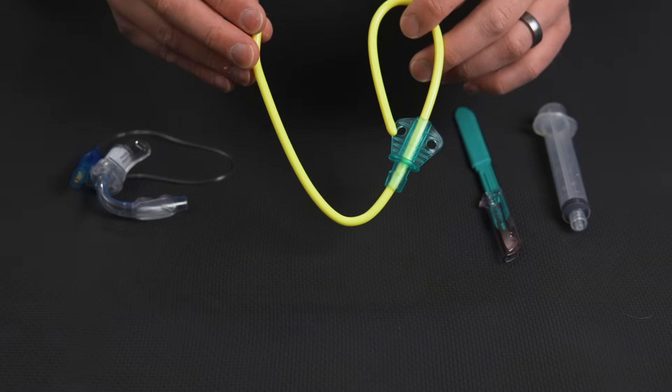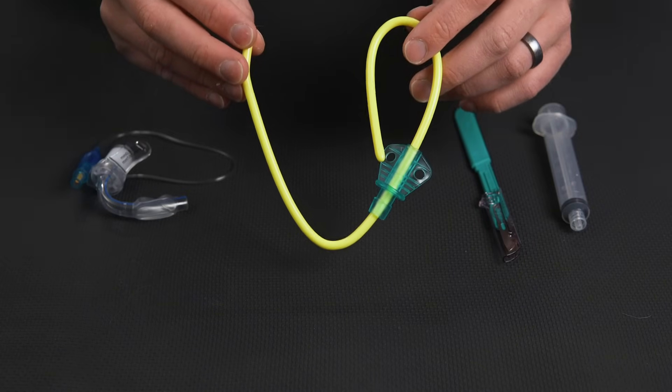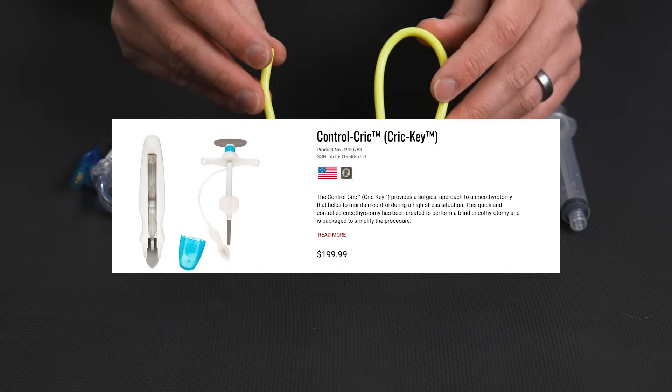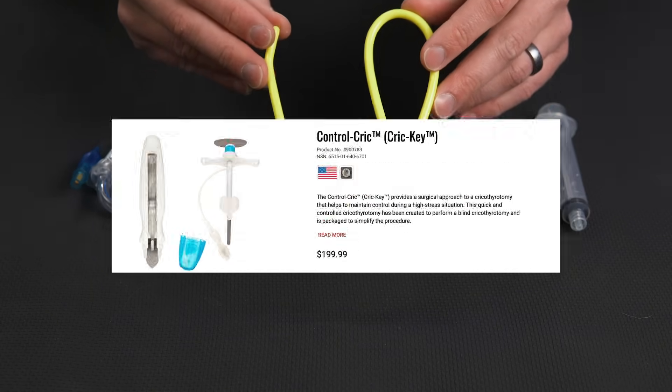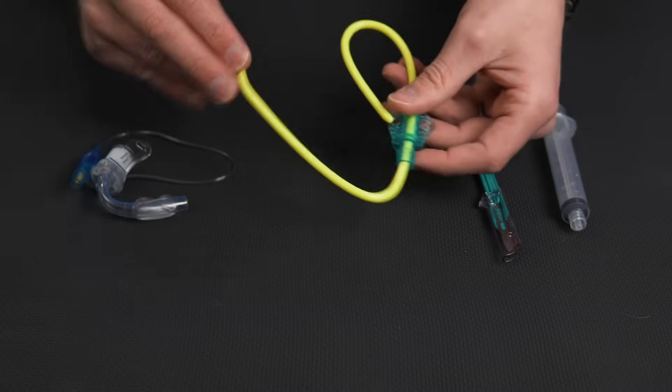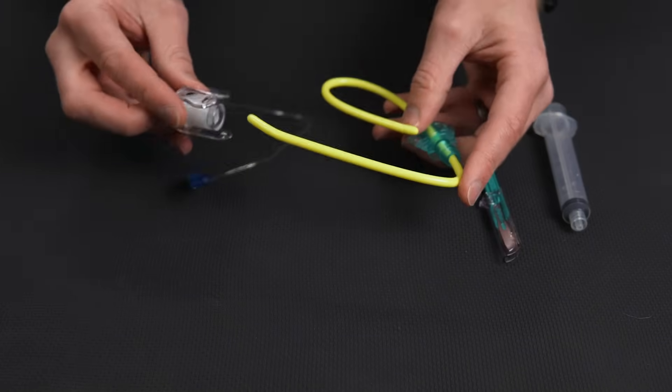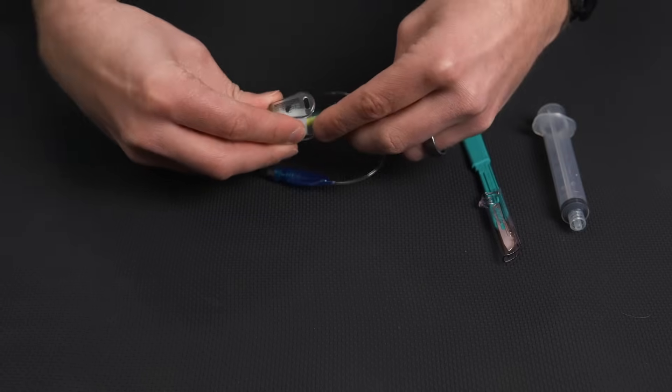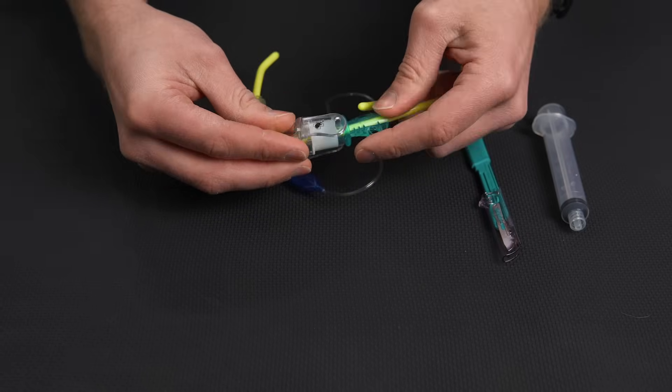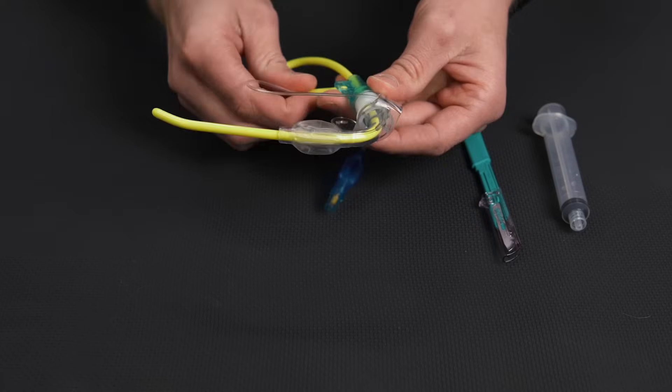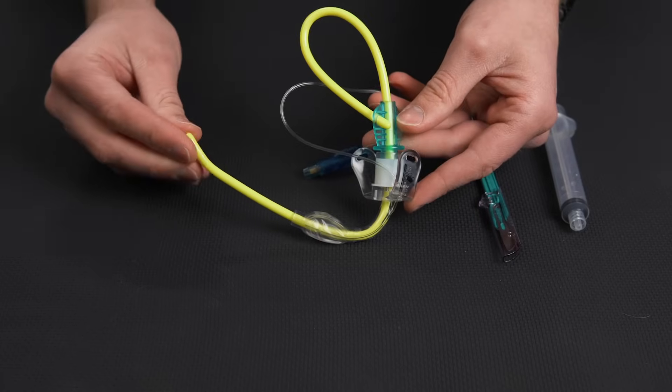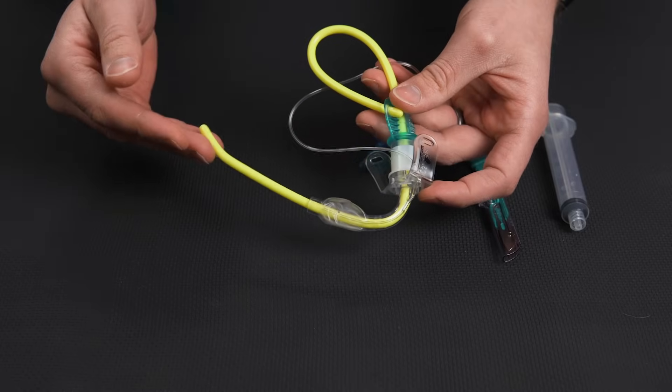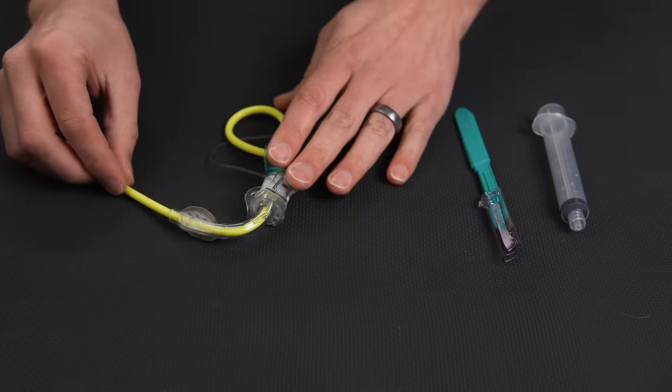There is another device out there called the cric key, which is actually what is recommended by the committee for tactical combat casualty care. I will tell you that device is very expensive coming in about $200. You can get this combo here for about $27 without a pro deal, and then you can get it actually for $11 if you're a professional and have a professional account with North American Rescue.